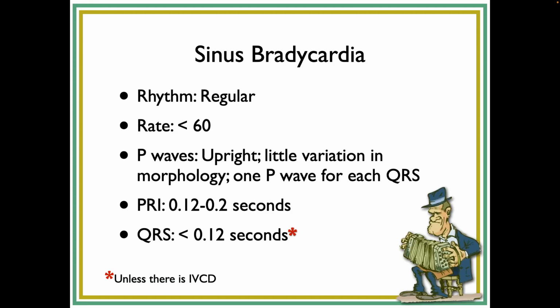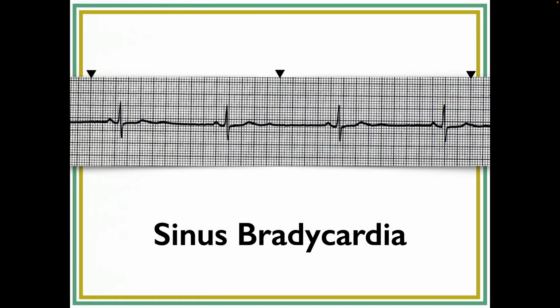Okay, sinus Brady. Again, exact same slide, but the rate is less. Okay, sinus Brady, in this case, 10, 20, 35.